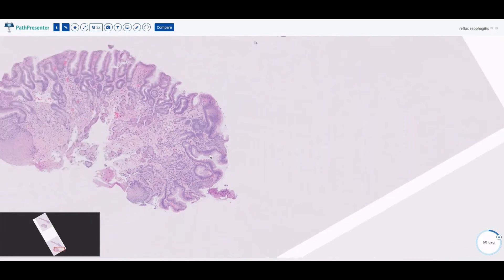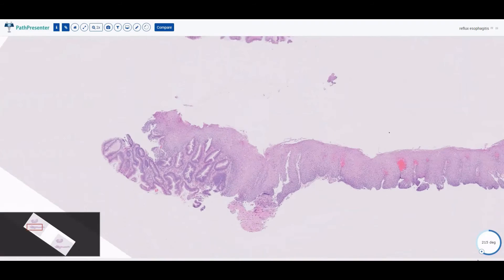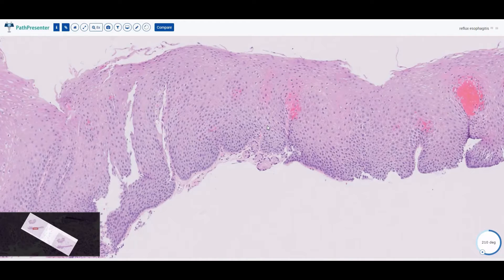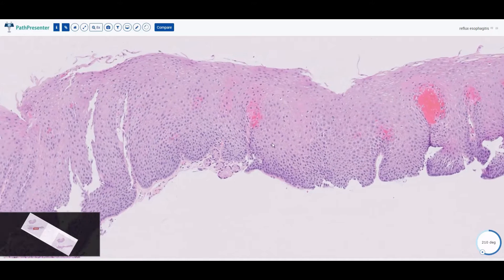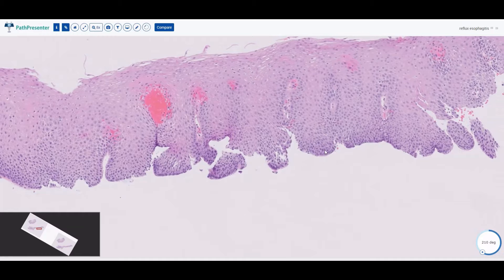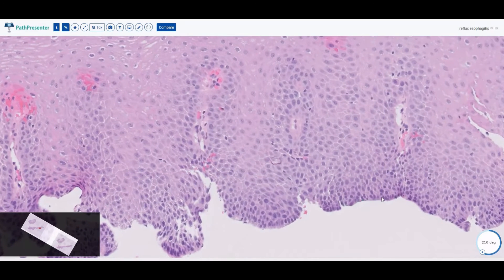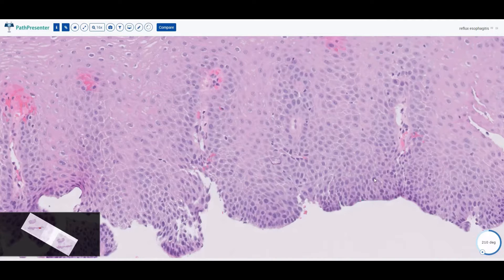So this is a biopsy of reflux — let's talk about the features of reflux esophagitis. Features of reflux esophagitis basically involve looking for reactive epithelium. First, you have hyperplasia of the basal layer: the basal layers tend to get thicker, with larger darker round nuclei that go higher up than just the one cell layer at the bottom — maybe four or five layers up — so this is thickening of the basal layer.